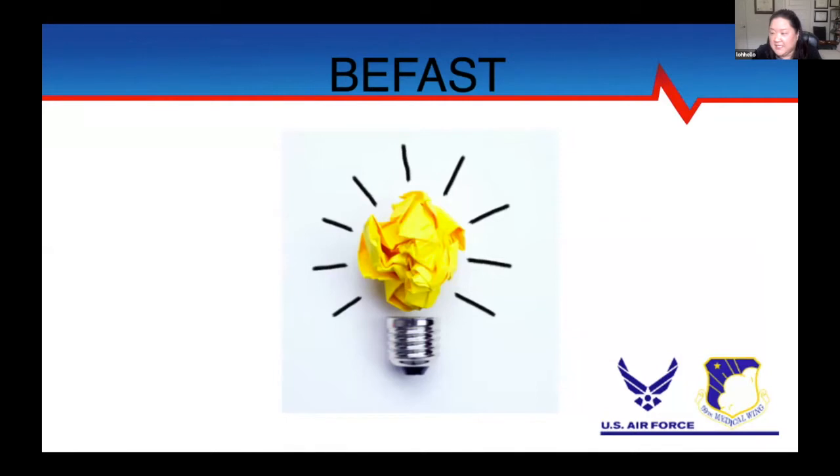So we thought that we would apply for military funding, and we highlighted situations where a soldier might be acutely injured and not be able to get that CT scan due to danger and costs. So our grant proposal to the military was that this was an important triage tool in the field and could be used at point of care.